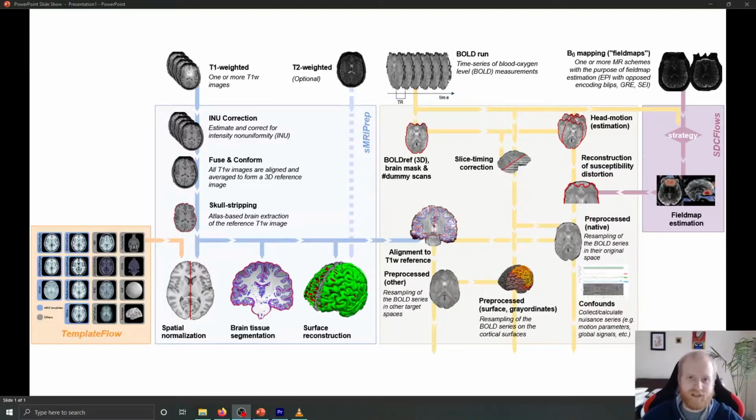So what I would suggest is you go to the TemplateFlow website, look through the templates that you would want to use in your data. If you want to conform your data to the standard MNI space template, to the fsLR template, to whatever you want, look through those templates, and you can include those as options in the --output-spaces option whenever you're running fMRIPrep.